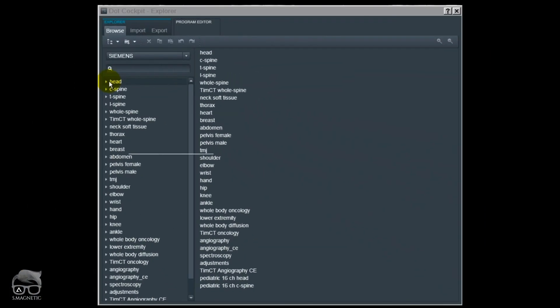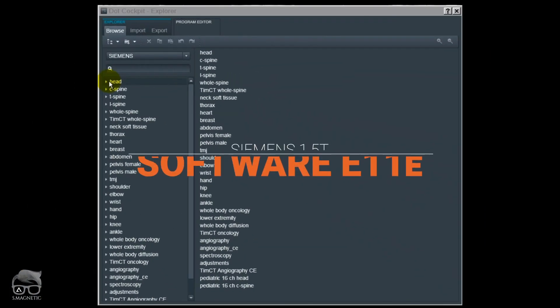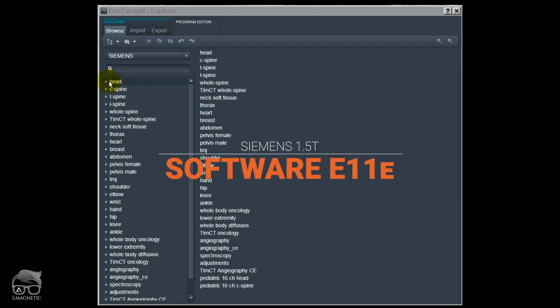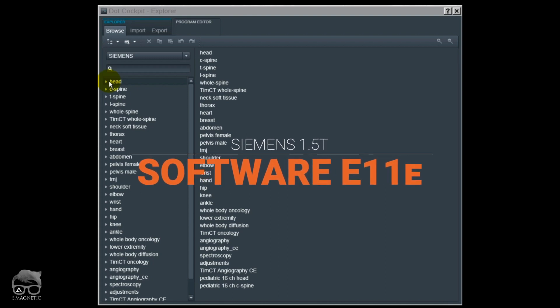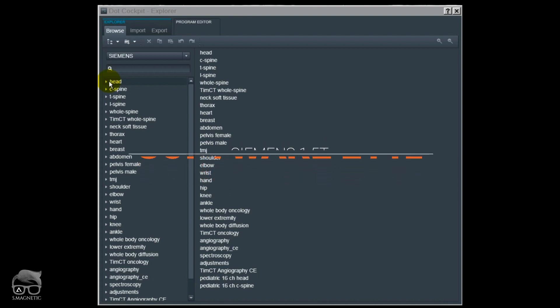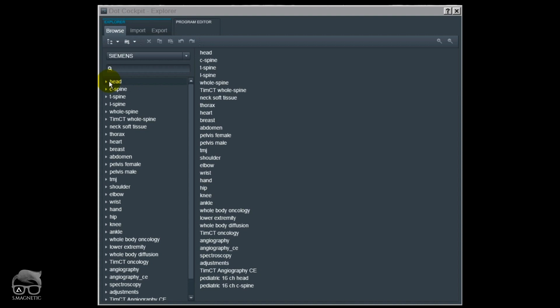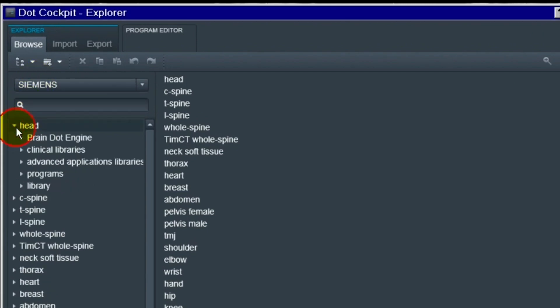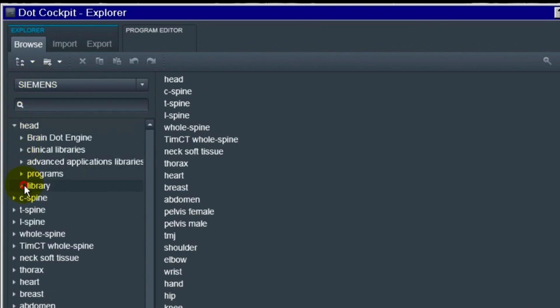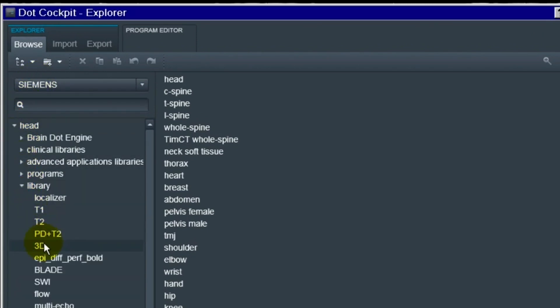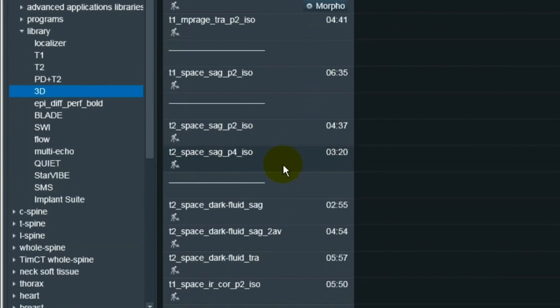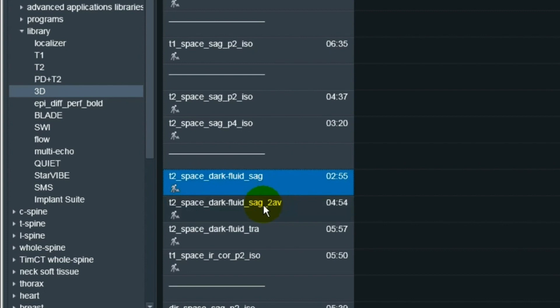I'm using E11E right now, and after the update from E11C to E11E, I notice a few things. Let's take one of them right here: the 3D FLAIR. We go to the Siemens tree, we go into the head, we go to library, 3D, and then we scroll down to the FLAIR. You see you have one sagittal, two sagittal, and this last one is the transversal.